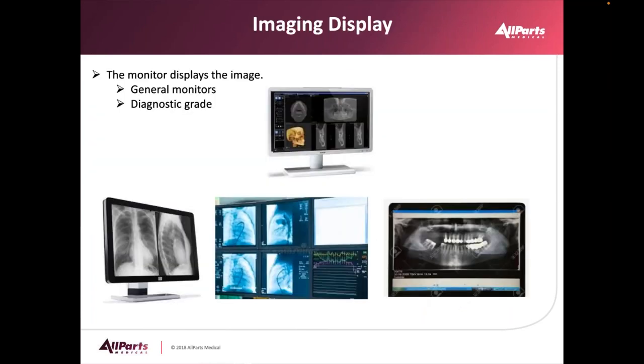Now that we have our digital image, we need something to view that image on. So in the market, we got multiple different manufacturers who make monitors. There's general purpose monitors, such as a computer monitor, and then there's the diagnostic grade monitors, which are used by the doctors to create treatment plans. You will also find in the cath lab a large 70-inch monitor, which you can display multiple images on.